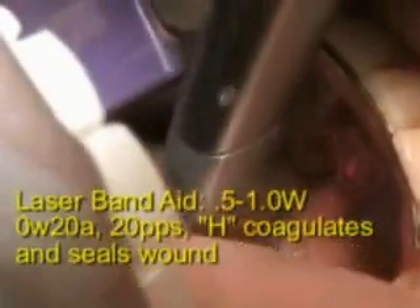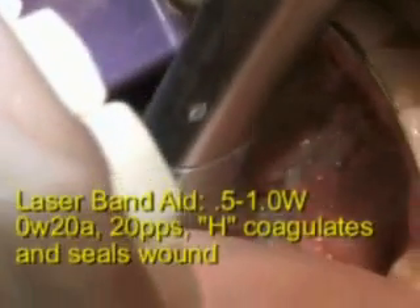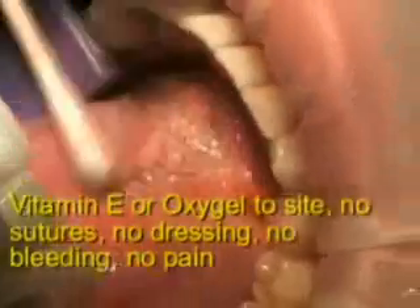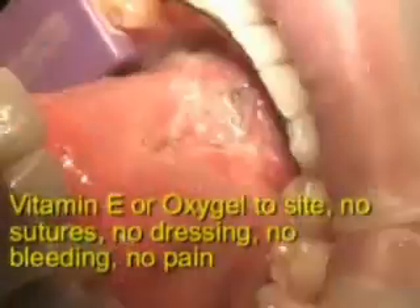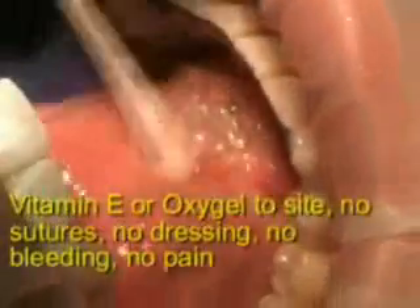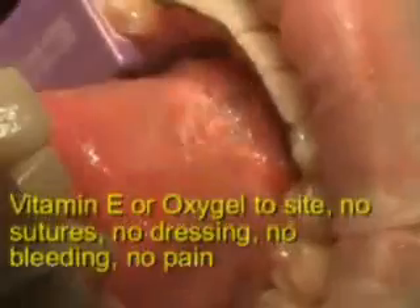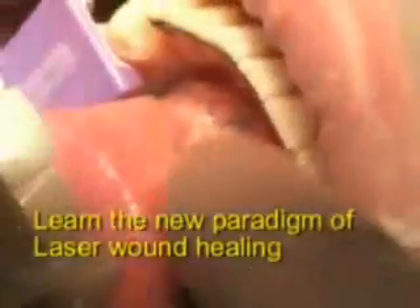Now here you see this band of tissue. With the water laser, with the laser energy, I can vary cut depth. I can get it down to just cellular level cuts, whereas with a scalpel you're on a very gross level. And no sutures, no dressing — just a beautiful non-inflammatory wound site.